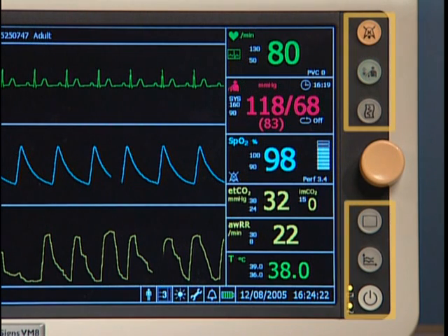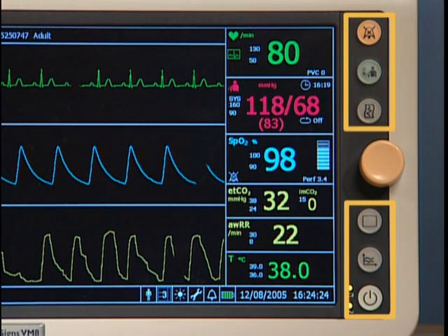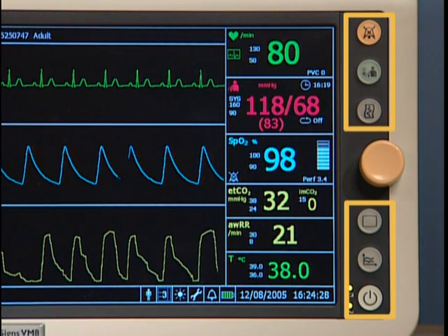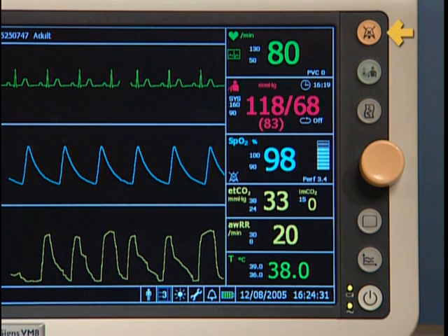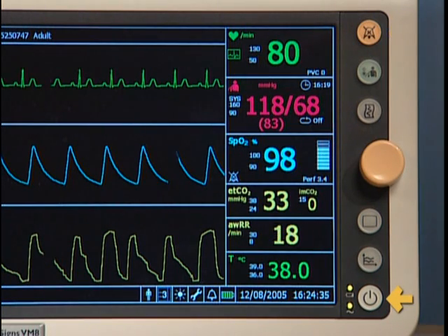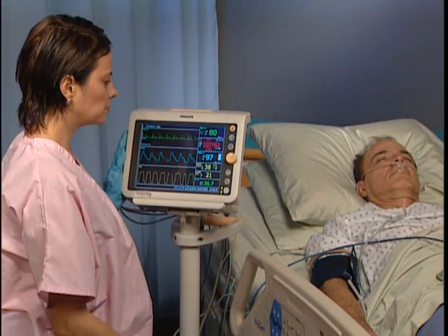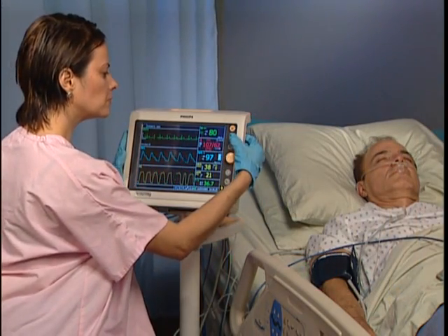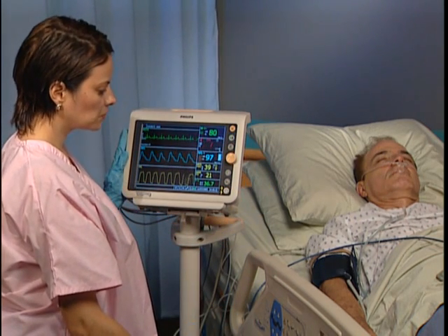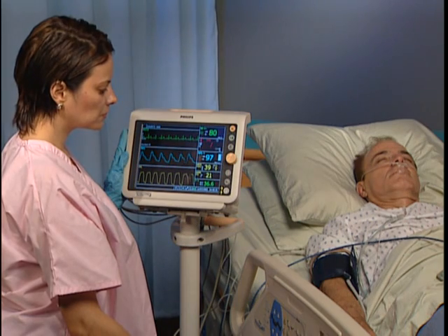The buttons along the right side of SureSign's VM Series patient monitors provide quick access to key functions. This is the alarm silence button. This is the ON standby switch. Press the NBP button to initiate an NBP measurement; if an NBP measurement is underway, press it again and the measurement stops.